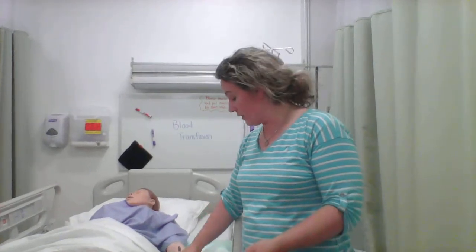But this patient has a peripheral line, so we're going to use this line here and make sure that it's patent. The other thing we're going to verify is that the IV size is at least 20 gauge. It can be 18 to 20, so that the red blood cells won't be lysed on their way through.